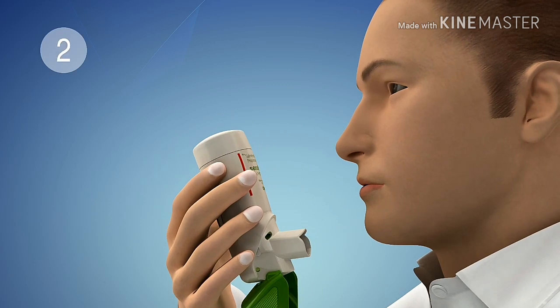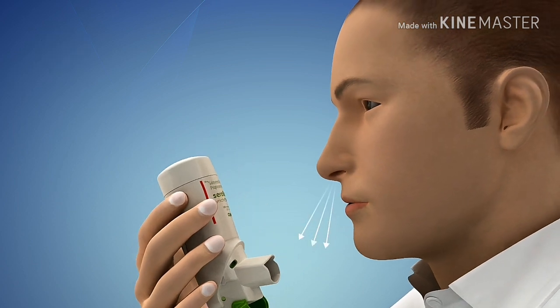Remove the SynchroBreathe inhaler from your mouth and hold your breath for 10 seconds or as long as is comfortable and then breathe out slowly.